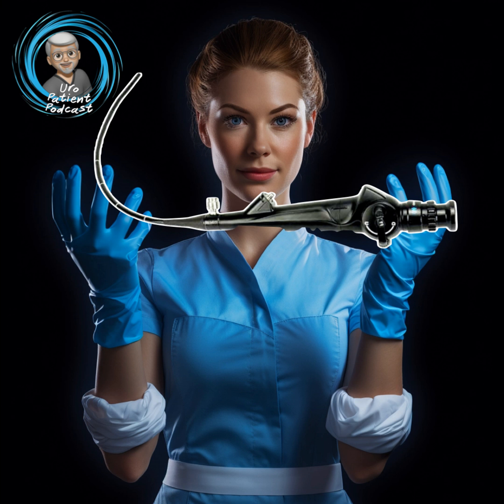Here's an example of a doctor using a rigid scope. As you can see, you kind of have to stretch out the curves, and we'll go into more detail about how men are built on the inside — that makes the rigid a little bit more difficult. And this is what it looks like when you're looking down through that scope — that's the urethral channel, and you can examine all the walls, so you really get a good view.